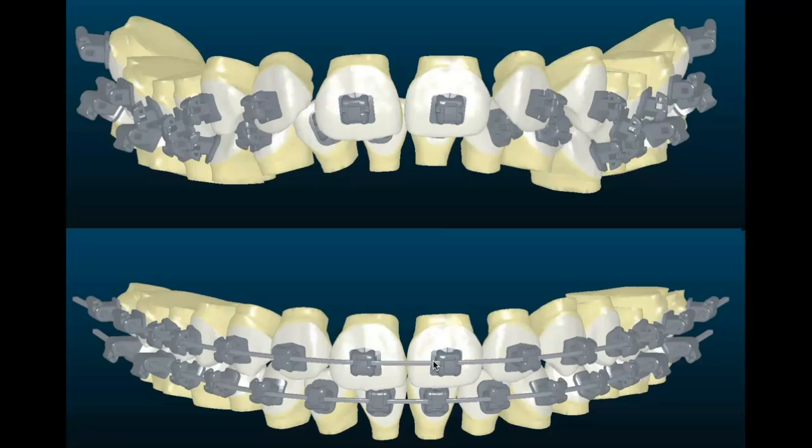So essentially it was 100% customized, meaning this wasn't just a prescription, like, oh, my upper anteriors have 10 degrees of torque or whatever. Every single torque and tip, anything that you put into the bracket, was basically recreated by allowing the bracket portion to be welded to the base portion. So it was basically the first of its kind. Now, unfortunately, the only system they really allowed you to use this on was the Damon system. And at the time, the Damon system was a little bit more difficult to finish in than it is now, due to bigger slots and some other things. So I did about 30 of these cases. And when I debonded my last one, it was like, hallelujah, I'm never doing that again.